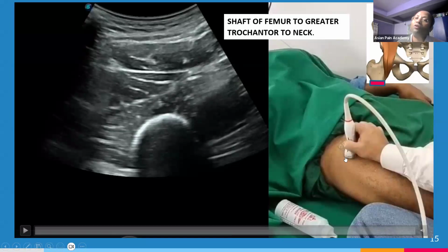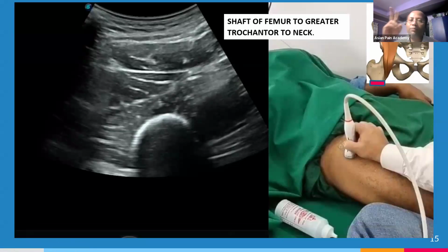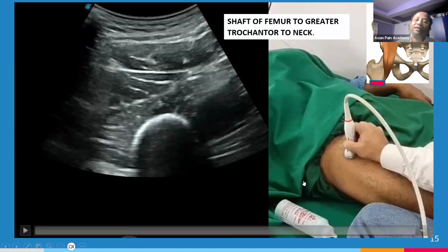This is a short axis view for femur. Okay. Remember, there are two things in ultrasound, one is plane and one is axis. Plane is fixed, that is either coronal plane, sagittal plane, axial plane, so these are fixed things. There is nothing to think much. But when we talk about axis, then we talk about a specific thing. Like if I say that I am seeing short axis, then it doesn't mean anything. I have to say that I am seeing short axis of femur.